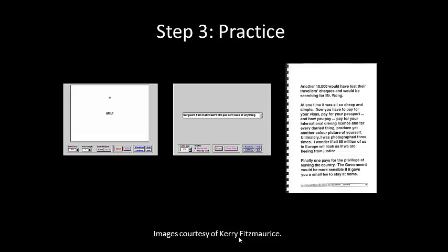And then the example on the far right hand side is a practice book from the ECView Home Resource Kit. My apologies, from the Home Resource Kit, which is the one that's associated with the cow picture and the smiley face picture, and the patient can use that at home and practice their eccentric viewing. They can also practice on newspaper headlines and any other activities.